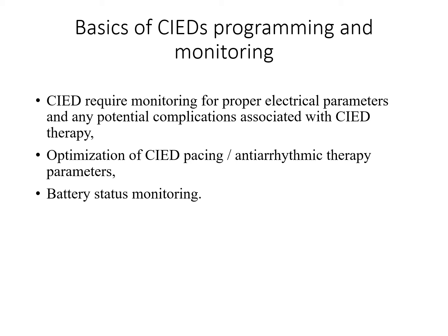Cardiovascular implantable electronic devices require chronic monitoring for the assessment of normal device electrical parameters and possible complications associated with cardiovascular implantable electronic devices. Based on data collected during the observation period, pacing parameters and/or antiarrhythmic therapy in cardiovascular implantable electronic devices should be optimized. The battery status of the implanted device should also be monitored.